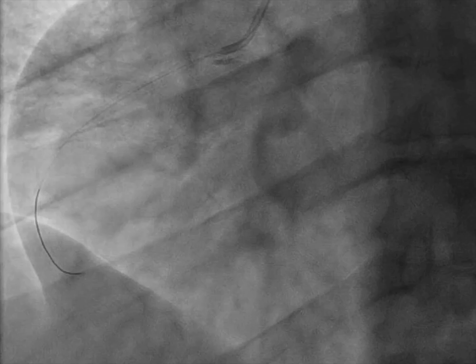In this video, we're going to talk through the post-intervention angiogram accompanying the blog post. I'm also going to show you an older angiogram from the same patient from many years ago so we can see some of the vessels by comparison to how they looked prior to the acute event in this vessel. But let's start with the current day angiogram.